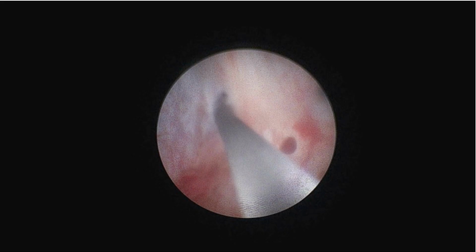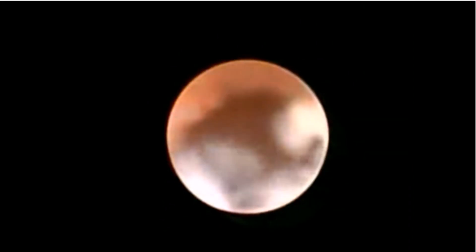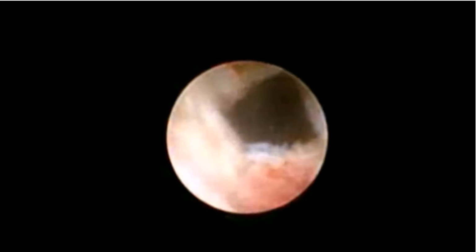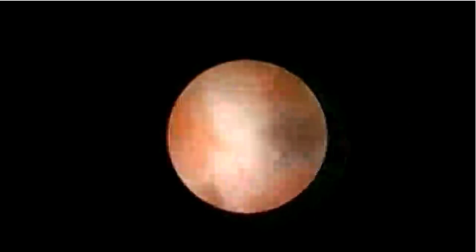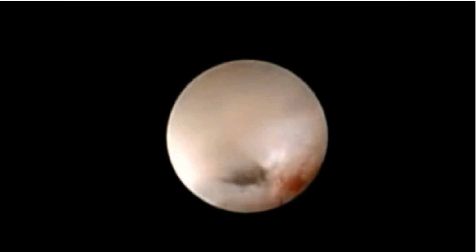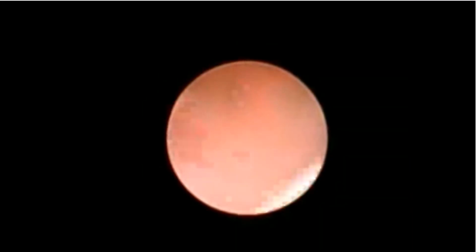We advanced the guide wire through the utricle to the junction between the utricle and seminal vesicle. A transutricular fenestration was created at this junction to gain access. Inside the seminal vesicle, a typical honeycomb pattern of the mucosal fold was observed. No further abnormality was noted, and the procedure was then concluded.